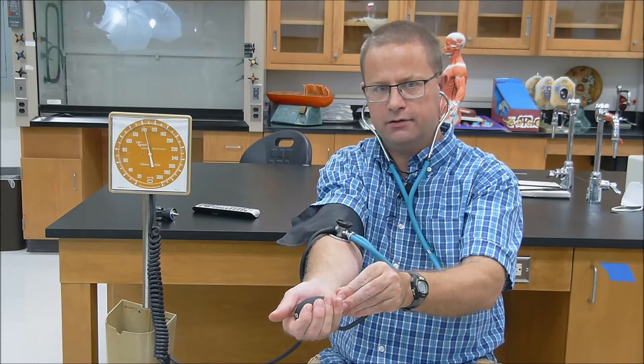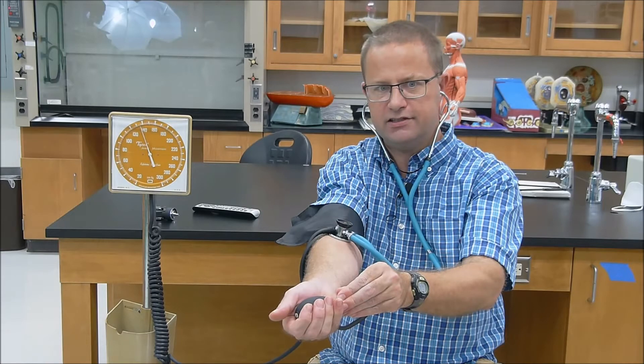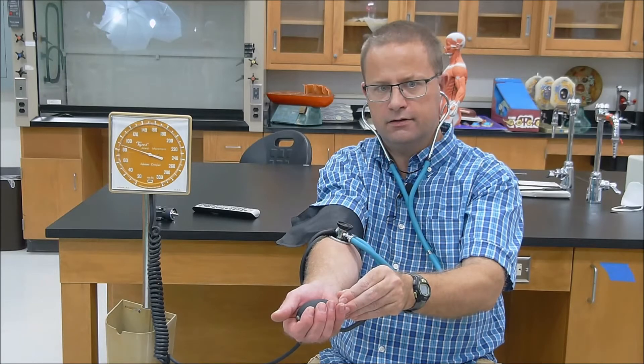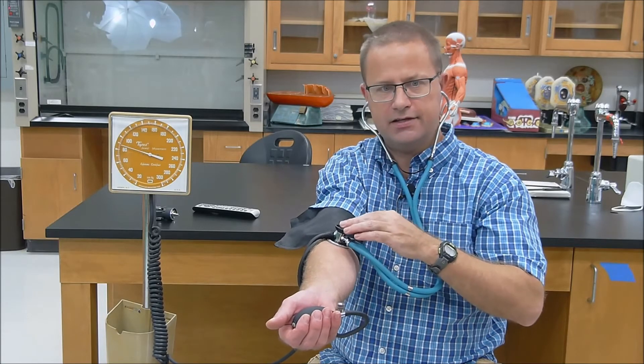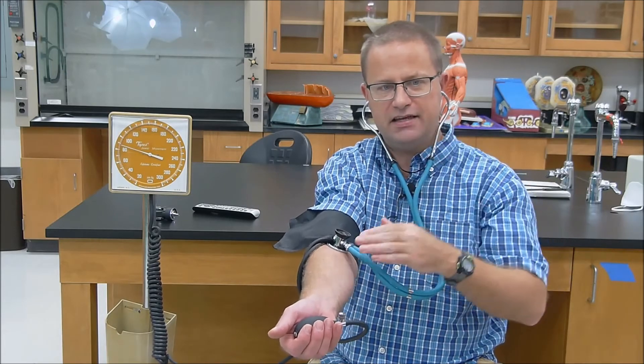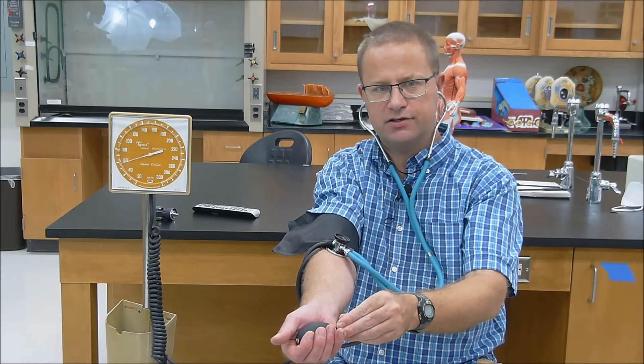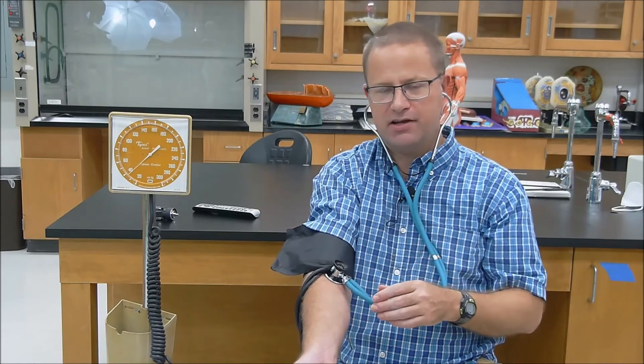I start to hear it now. What you can notice, look at that meter, you might see a little needle knock on there. A needle knock indicates that blood is rushing past there. When we first see that needle knock, it's probably going to be our systolic pressure, and the point at which that goes away becomes our diastolic pressure. It's hard for me to talk and measure all at one time, so I'm going to take my next measurement and just be quiet and try to get a good accurate blood pressure measurement.